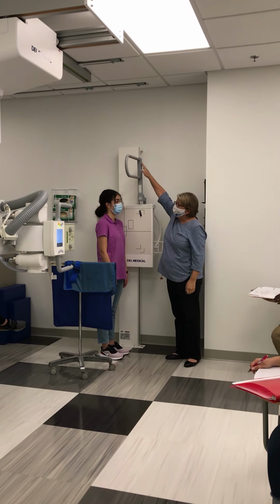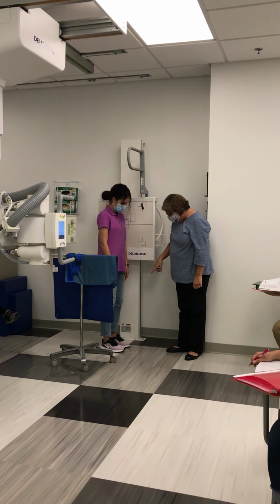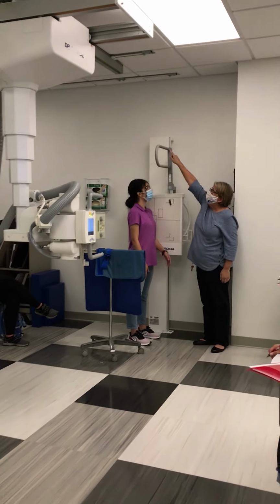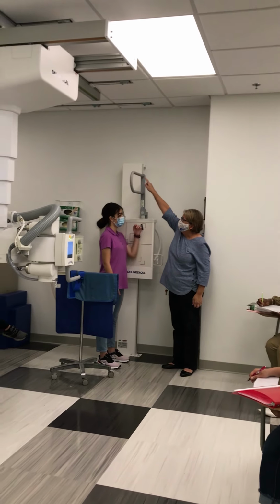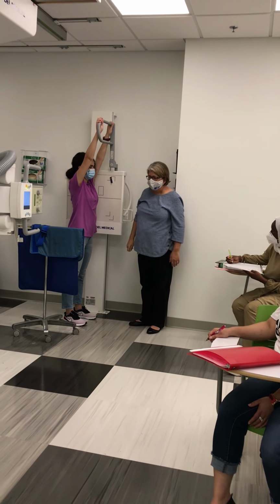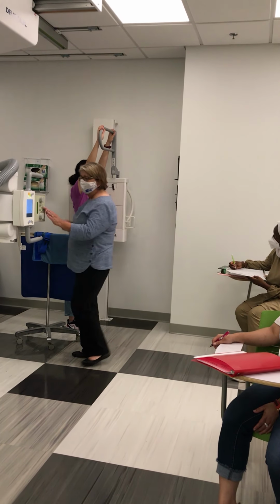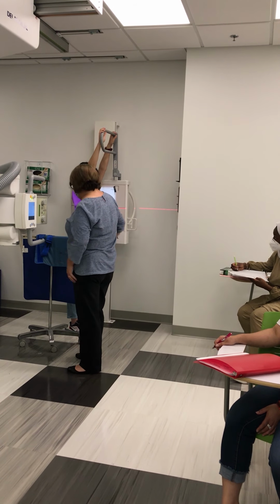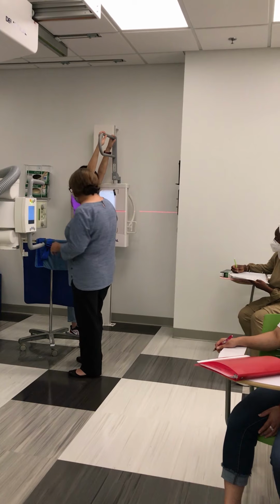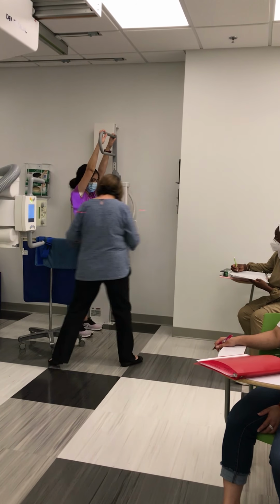I want you to stand with your feet shoulder width apart. Reach up and grab the top bar with both hands. Both hands like that? Mhm. I'm still at 72 inches. This hasn't moved. Collimated to 14 by 17.